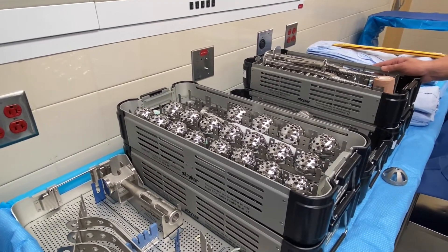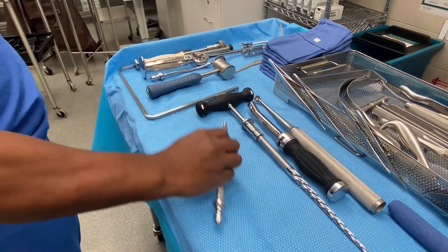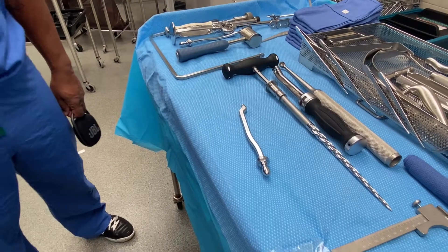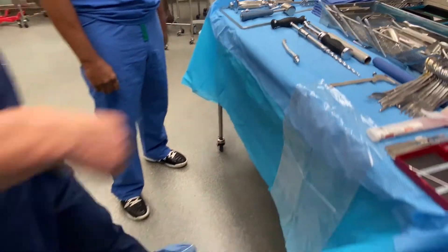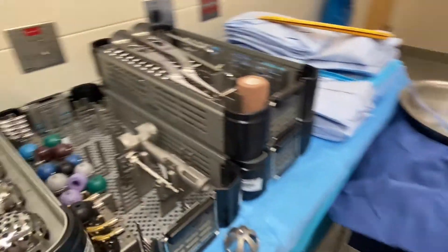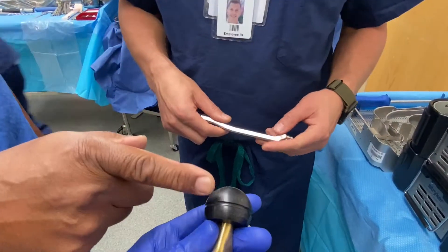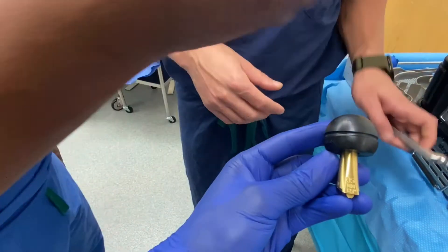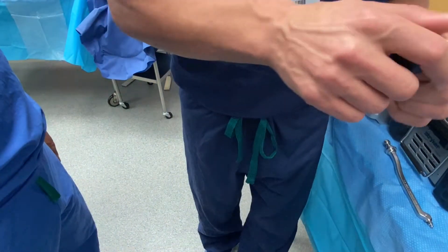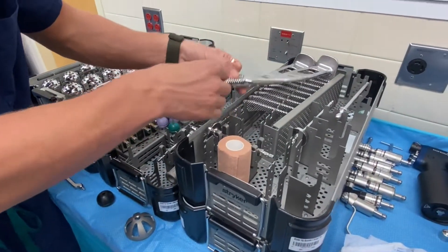That's basically it. Once you give me the component, I use this inserter. I don't use the one that controls version because it should only go one direction. This will click right onto the implant — that's for the trial. The different size head and collar is based on the size of the broach, and there's a colored sticker on here which corresponds with whatever neck size.